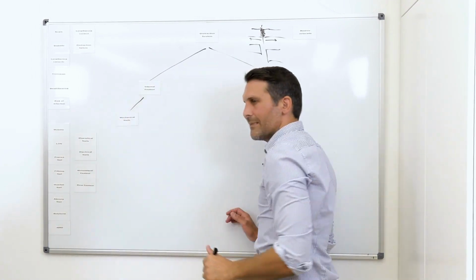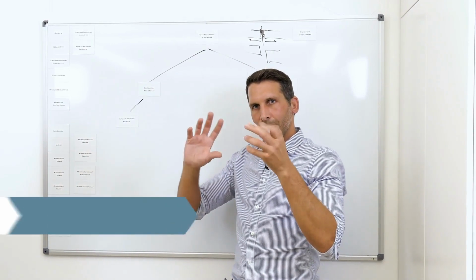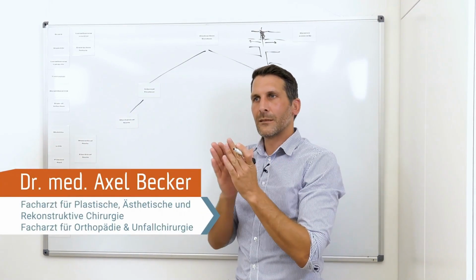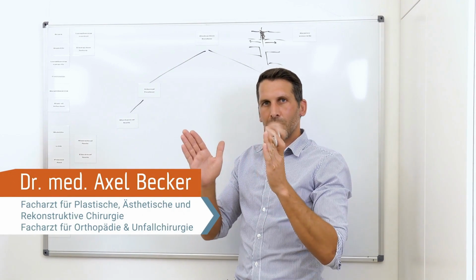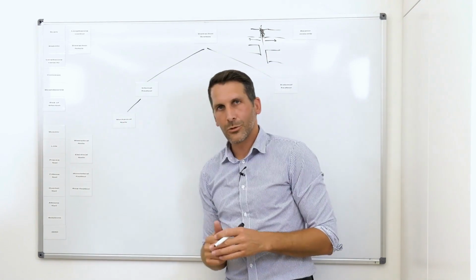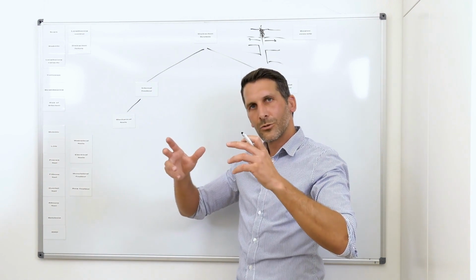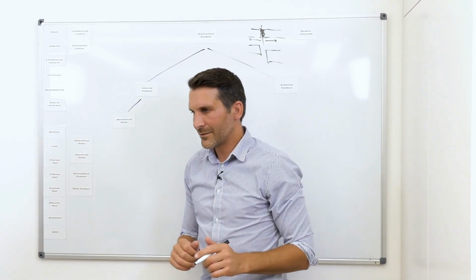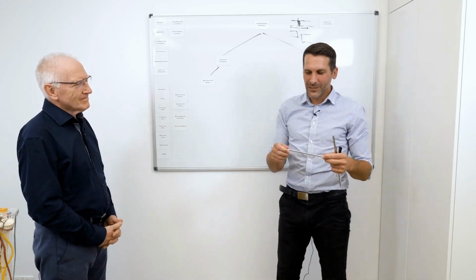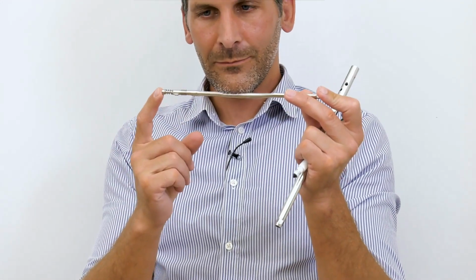These purely mechanical nails have nothing but a ratchet system. And through this ratchet system, the nail is pushed apart. That means the process of distraction in mechanical nails is really achieved by a thread that is connected to a micro ratchet system. I'm just demonstrating that with this system here, we have the inside of the nail, that's the casing of the nail.